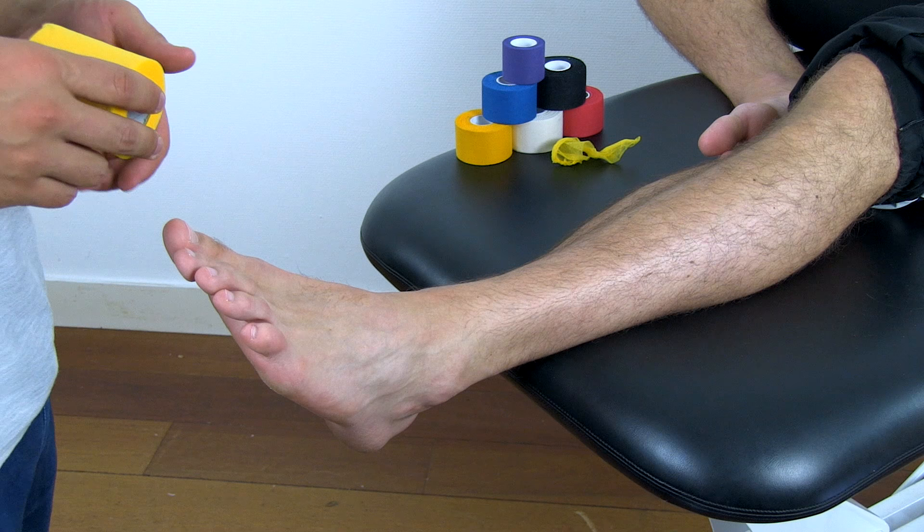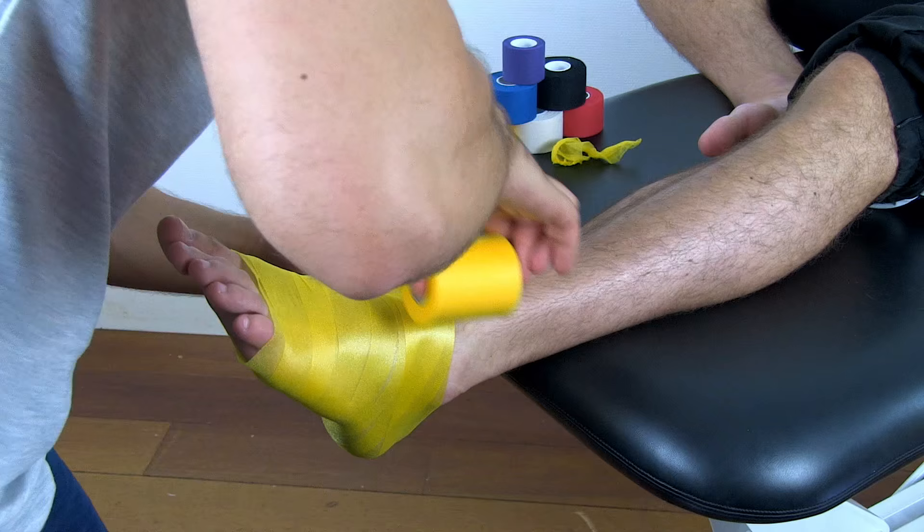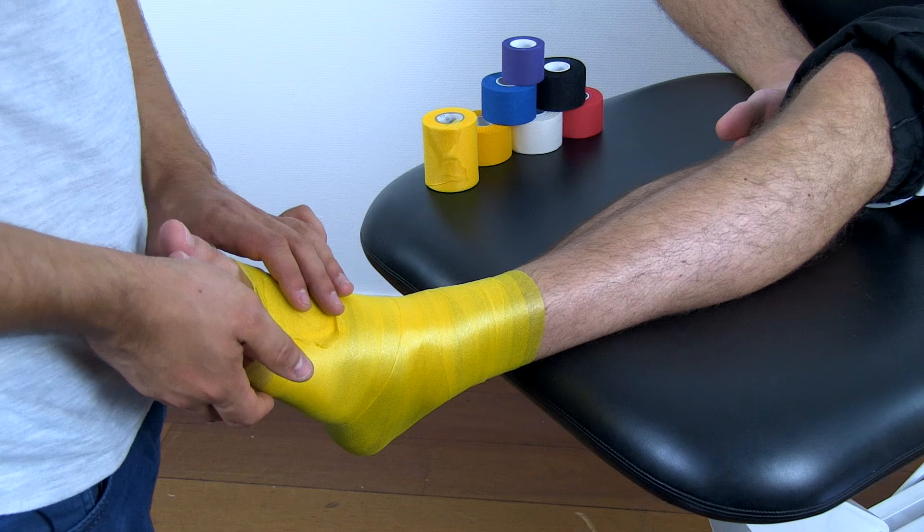First, apply a base layer of pre-tape. Before applying the rigid tape, make sure that the ankle is in a neutral position.